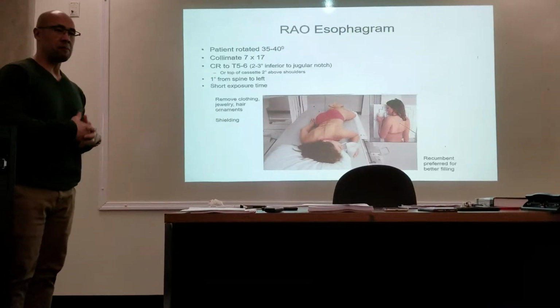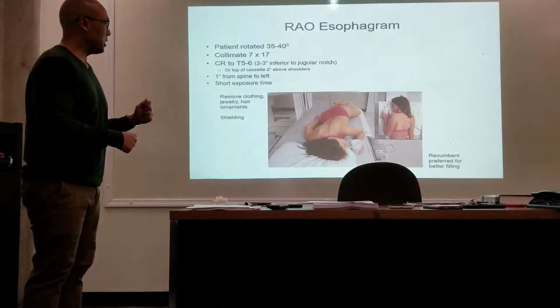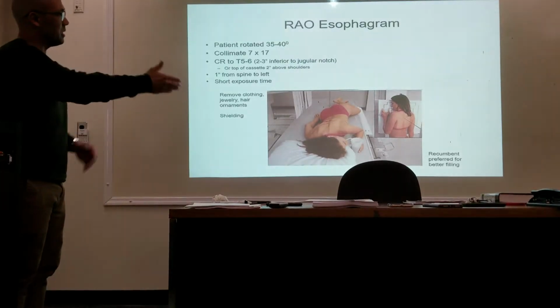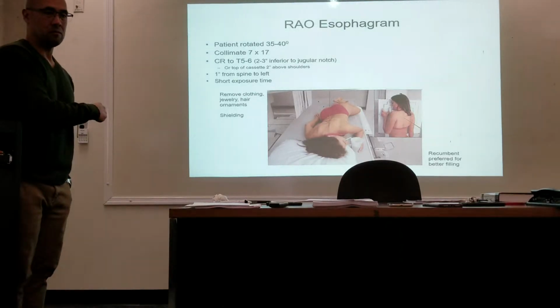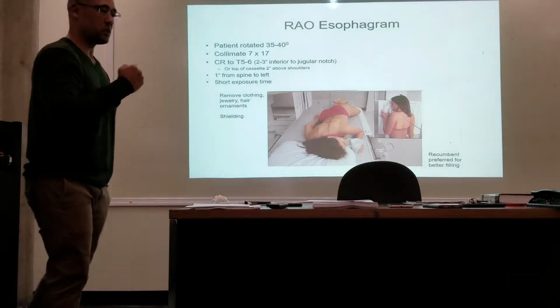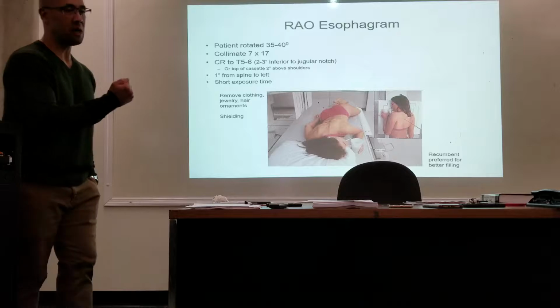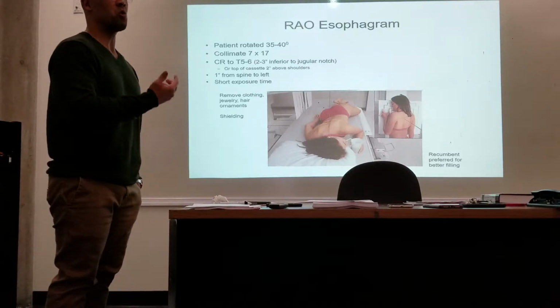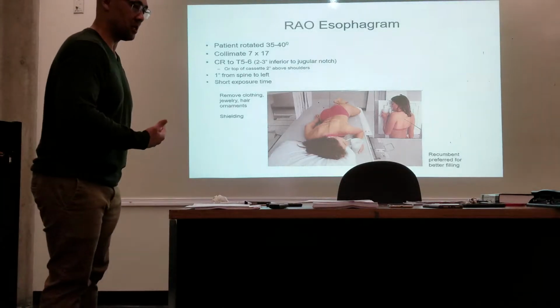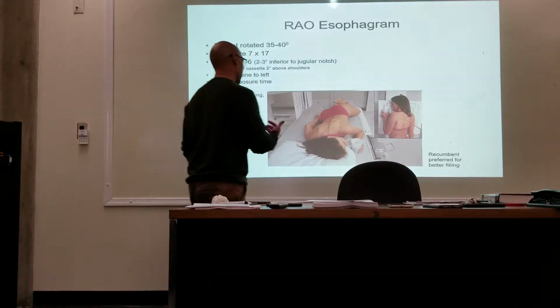When you get the room set up and you prep your patient accordingly, you're going to put the patient or the table in an upright position. Okay? It's going to be in an upright position with the footboard secure, the patient secure. Doctor comes in and he's going to do his fluoroscopic study, watching the patient swallow from the oropharynx down until it reaches the stomach. The patient will be standing in different positions.